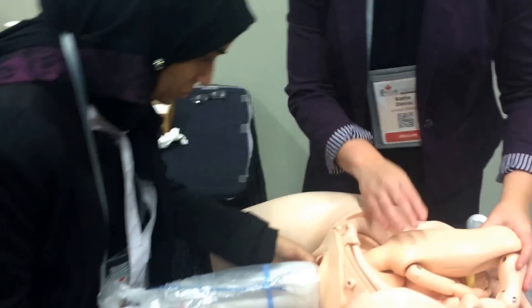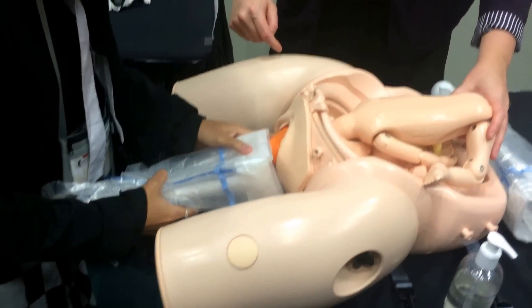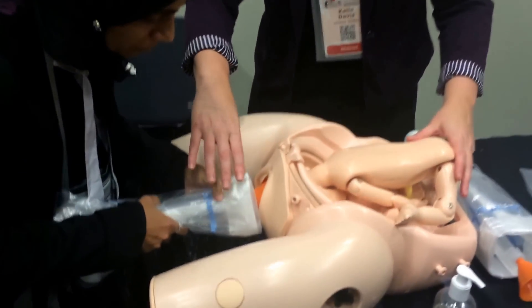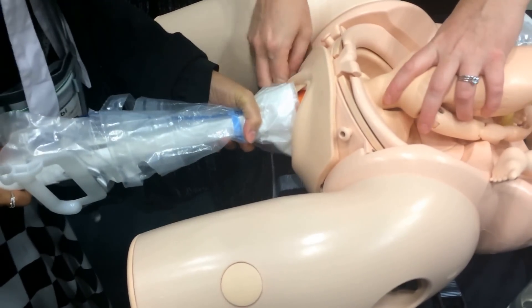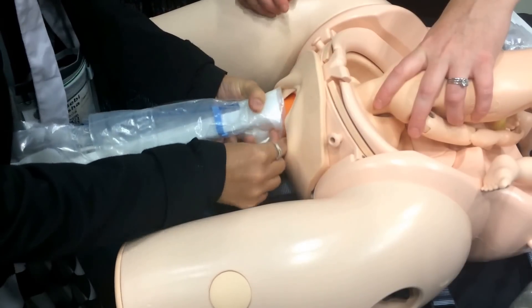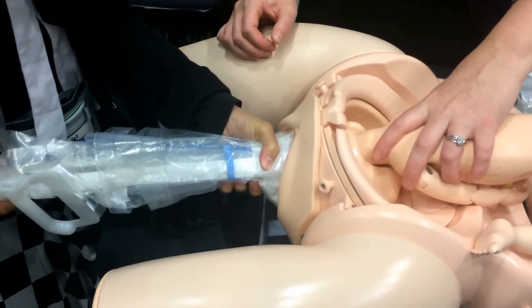Find the top of the baby's head and make sure the labia are not caught. You want to compress this and push it in — it can catch the labia, so you just want to be careful as you're pushing.